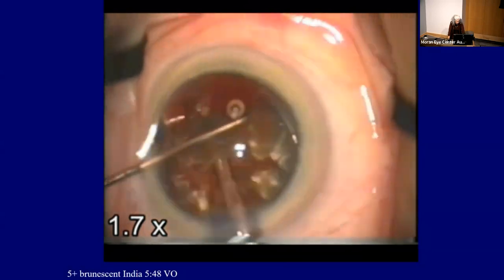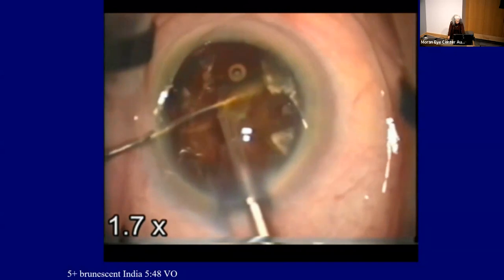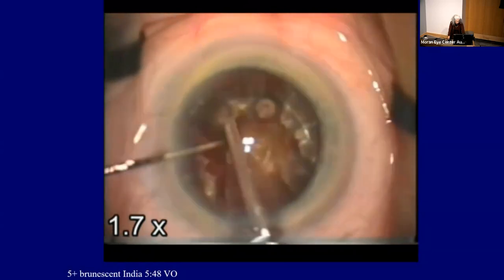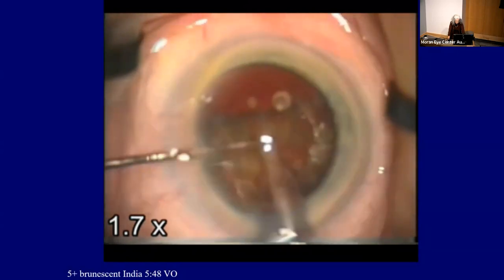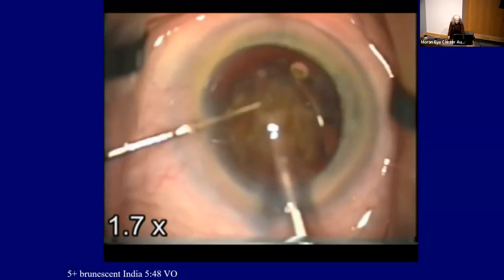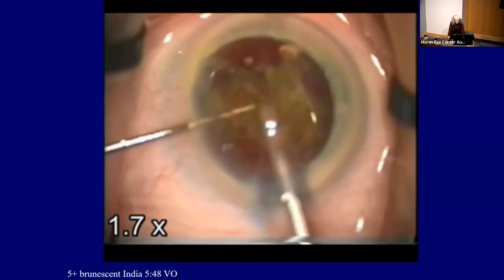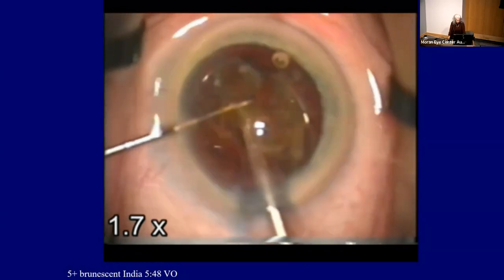And instead, now we're just starting to be able to take care of that endonuclear piece here. That epinuclear piece. You don't see the overlay in this one. You will in some of the other videos, where you'll see that it's about now or so that I reduce my vacuum and aspiration flow in order to prevent clogging. And of course, in order to prevent a surge and the posterior capsule coming up.